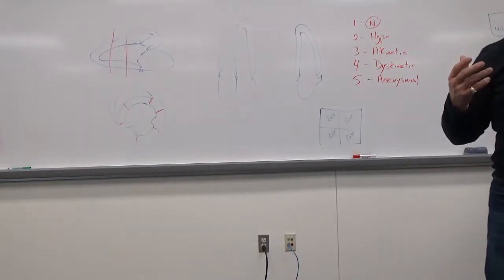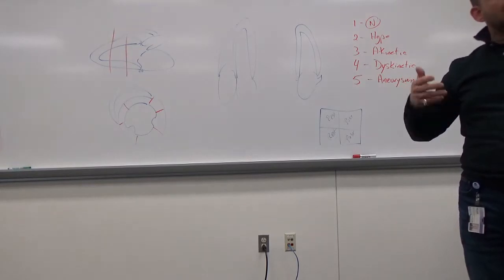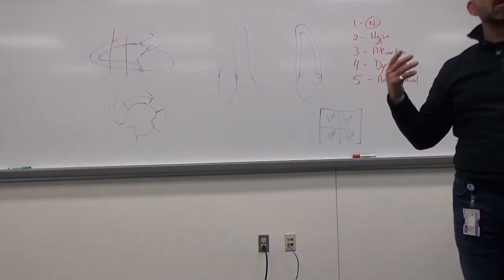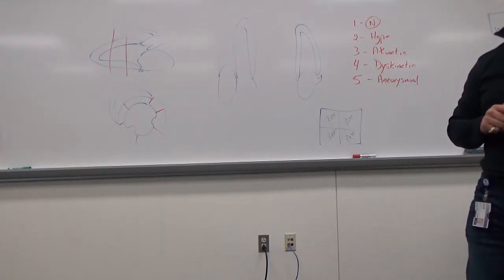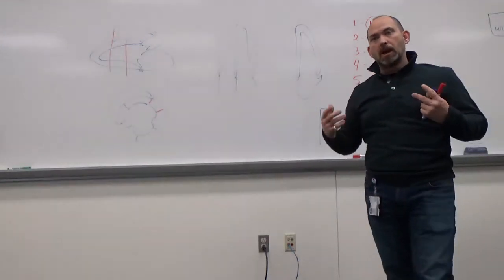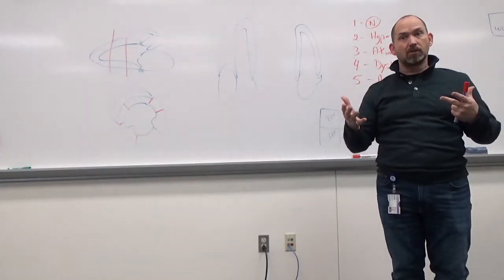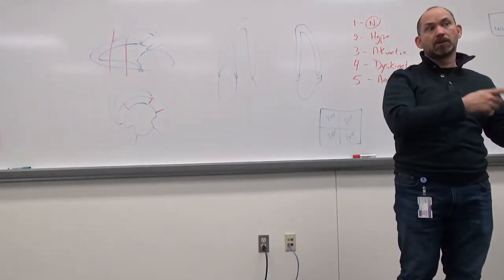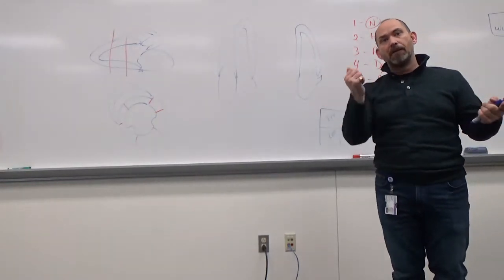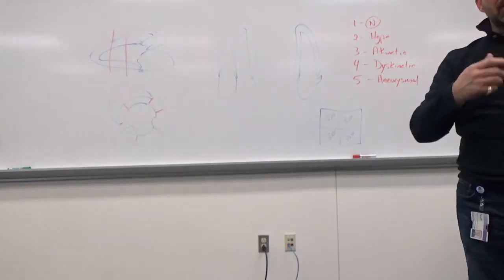You're going to do, on the resting echo, you're going to do the contrast first. It only lasts for a few minutes in the body and then it dissipates. So you'll actually need another injection of it before the stress test is over. So when your patient is getting to the end of the exam, you kind of gauge how they're doing. You have to monitor how close you think they are to getting ready to go, because before we get them off the treadmill and over to the bed, we have to do another injection. Okay? So you want to make sure that that's set up properly.